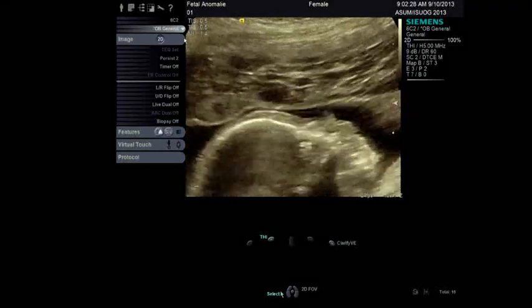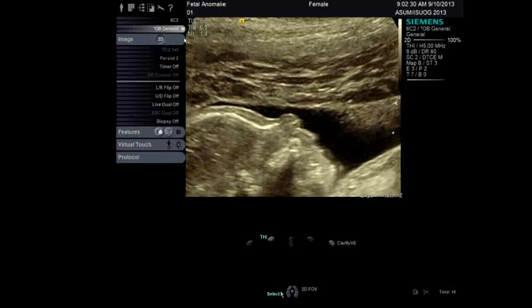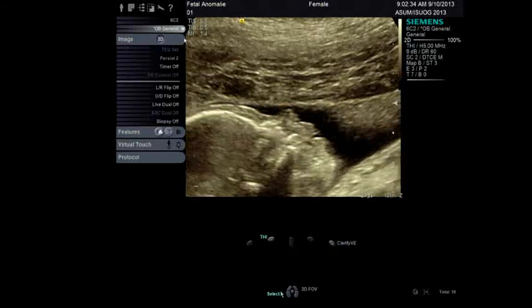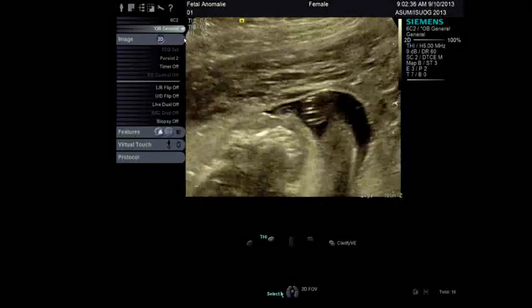That's a very nice demonstration of an examination. We take one question from the floor. If anybody has a question from the floor they would like to be shown.